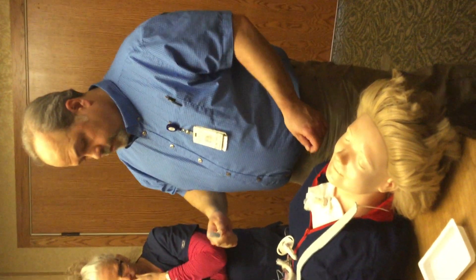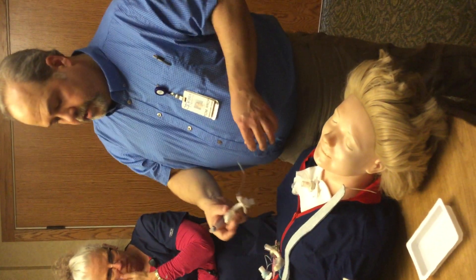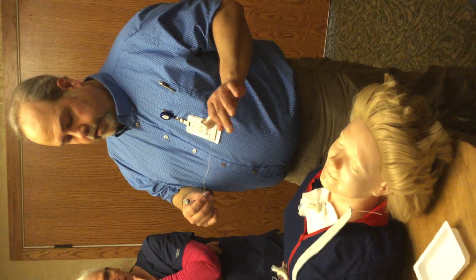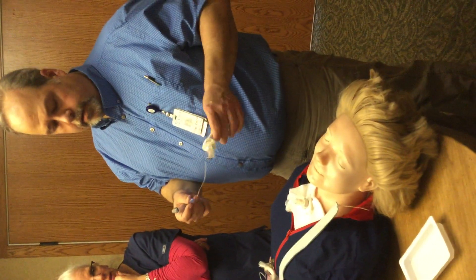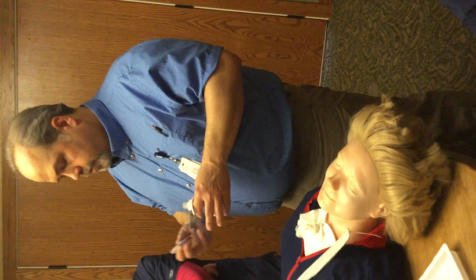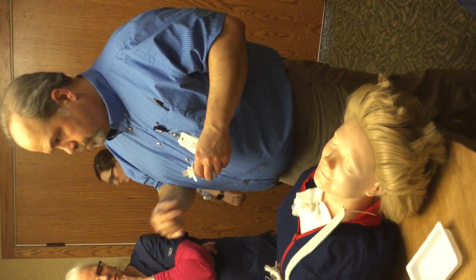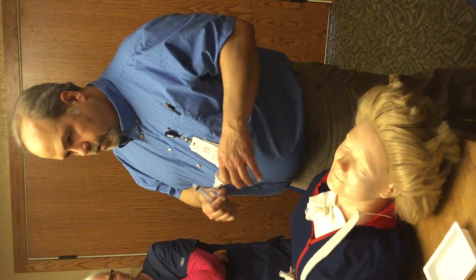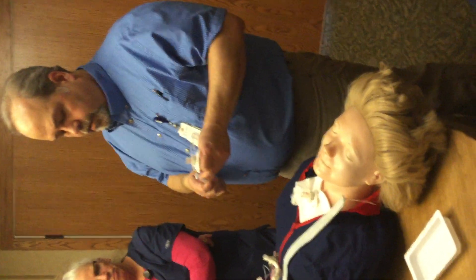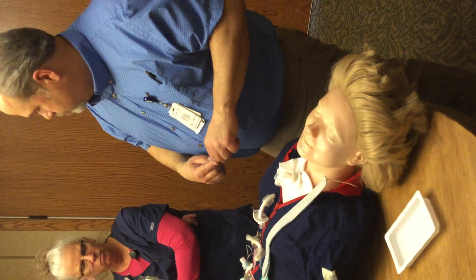The cuff inflation: about 10 mils will fill up the cuff. It doesn't have to be super taut — just until it feels snug, because depending on the airway, some need the full amount. If you've got somebody whose cuff needs to be up all the time and you're suctioning frequently, check their pilot balloon. If it gets a little low, the cuff starts sliding down and instead of pooling in their mouth, secretions go deep. Add a little air and see if that fixes it. That's the first thing I check on the floor anytime I'm suctioning every hour — it'll save you some long days.